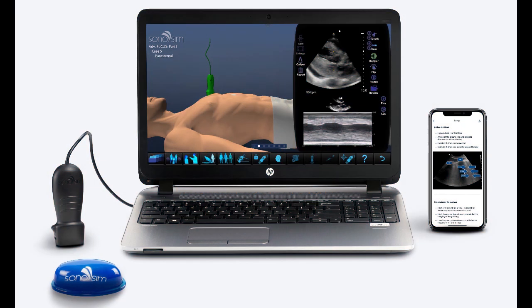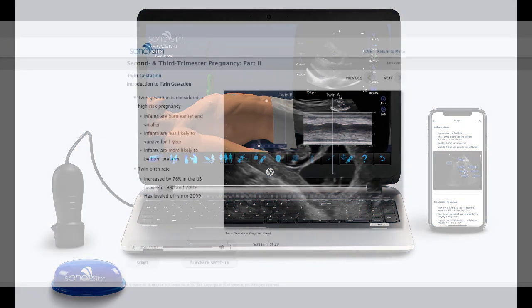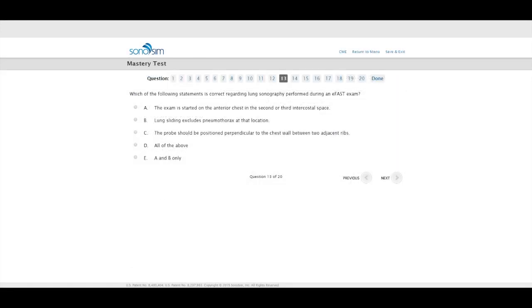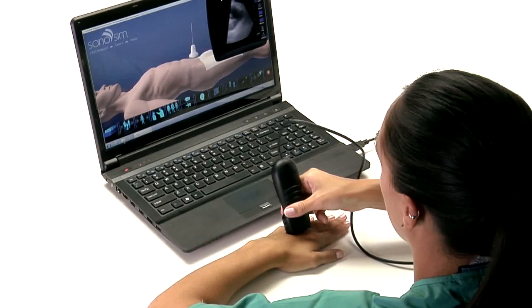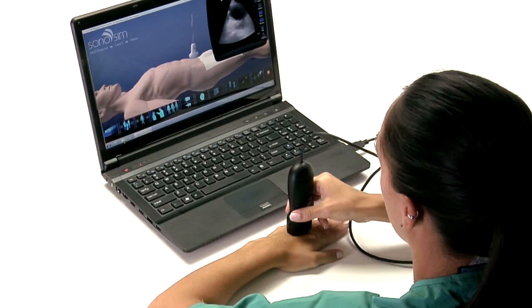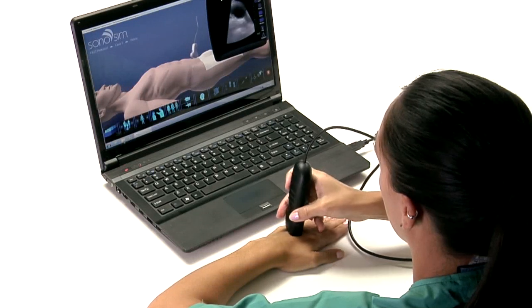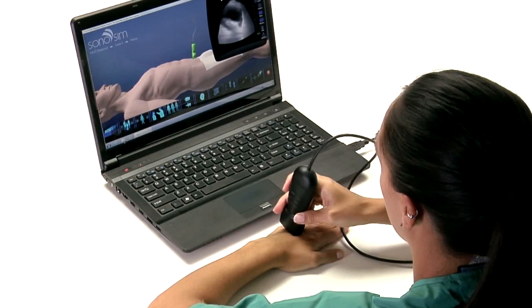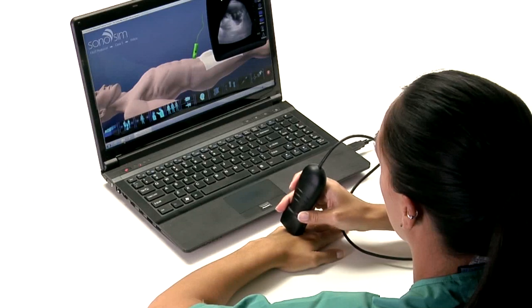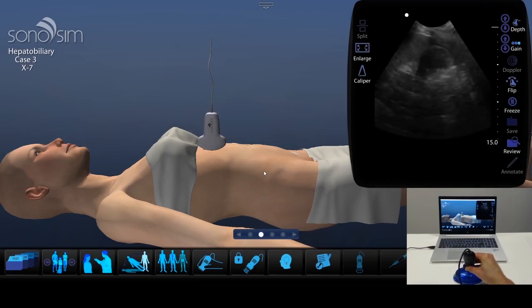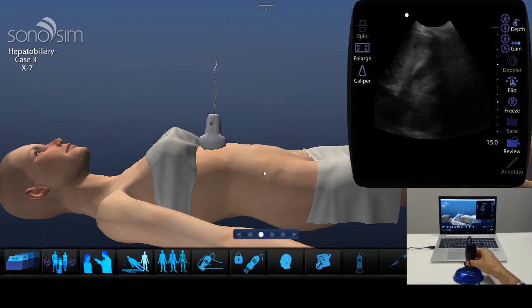The Sonosim Ultrasound Training Solution combines online peer-reviewed courses, knowledge assessments, and hands-on training with the Sonosimulator. The Sonosimulator teaches image acquisition and interpretation by allowing you to scan through hundreds of real patient ultrasound training cases with pathologies.